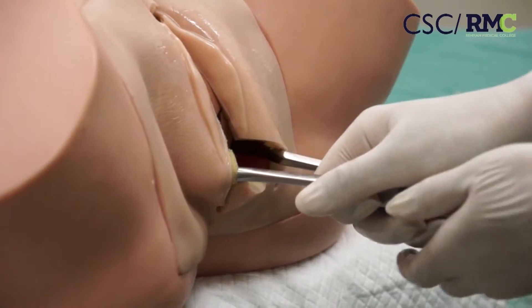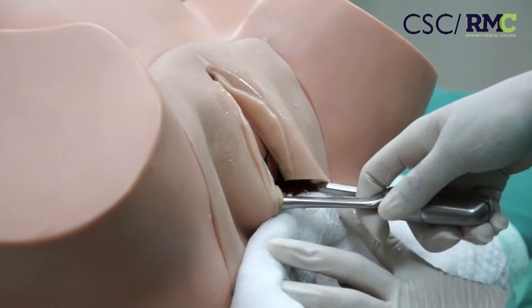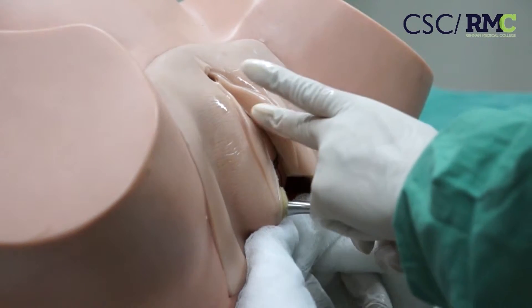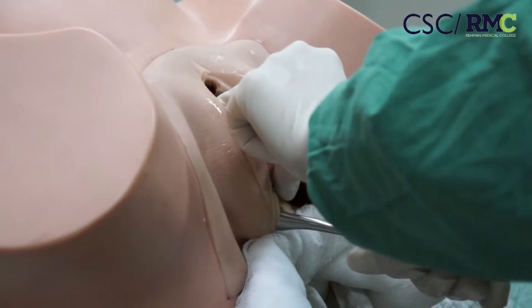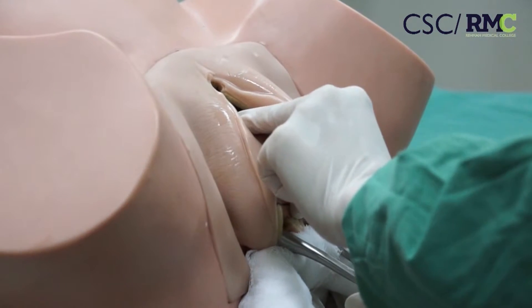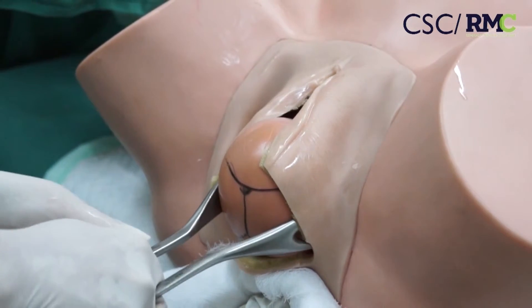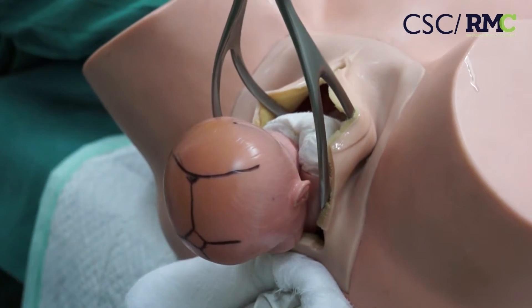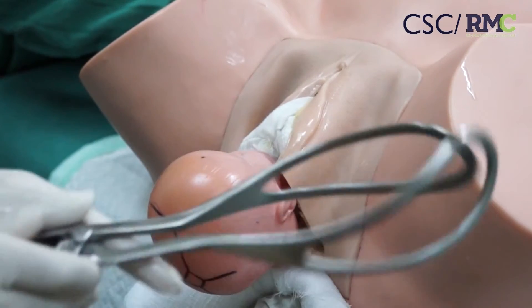Now wait for the maternal contractions to come. Ask your assistant to give proper perineal support. When the patient has contractions, use these fingers to help the baby's head to flex, and apply traction in the line of the pelvic axis — initially downward and posteriorly. At the time of crowning, ask your assistant to give an episiotomy, then change the line of traction from posterior and downward to anterior and upward. This will help the baby to come out.